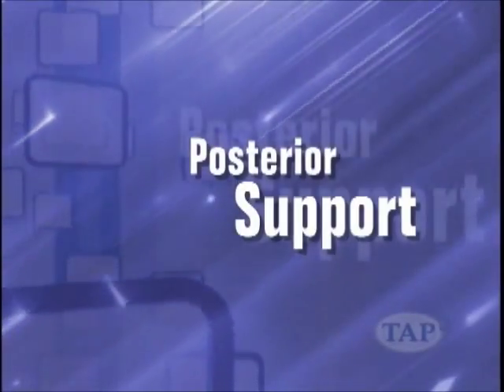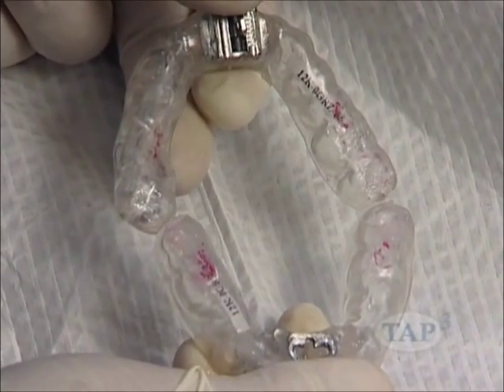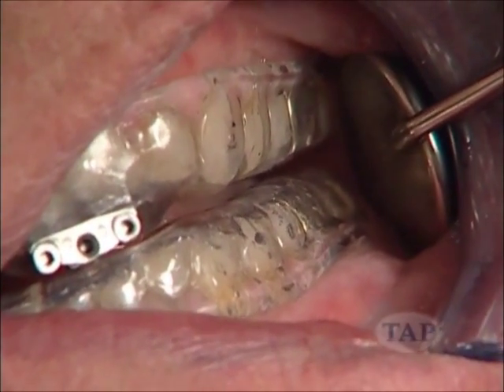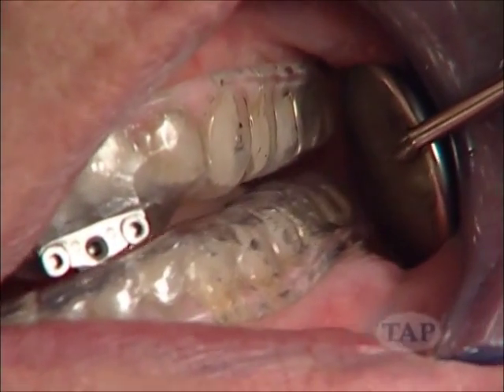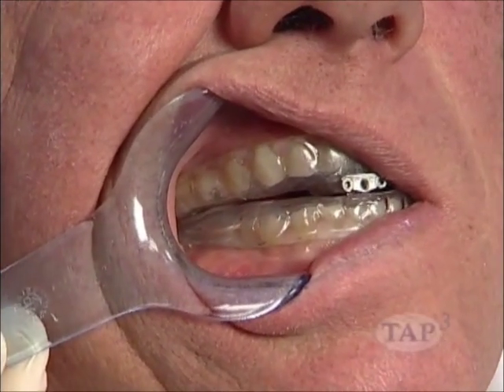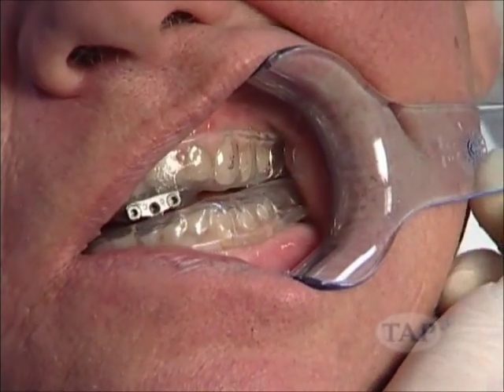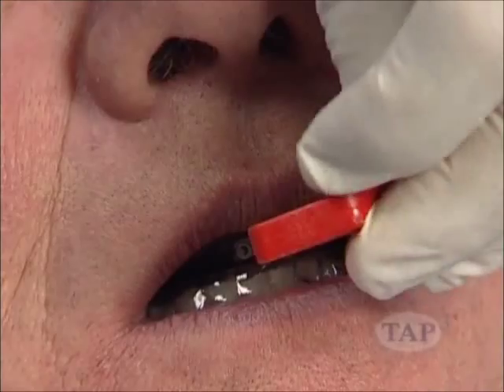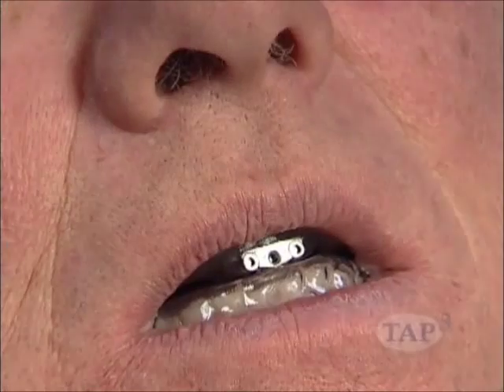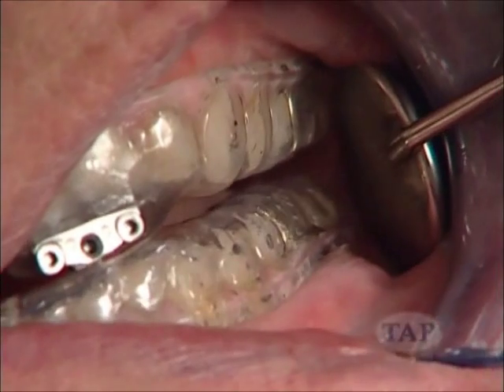Posterior support. Posterior stops can be added at any time to support the temporomandibular joint. It is extremely important that there is a space bilaterally between the trays prior to adding the acrylic posterior stops. The objective is to create bilateral, even posterior stops at the patient's treatment position. Since the relationship of the maxilla and the mandible changes with the changes in protrusion, this procedure must be repeated if the treatment position changes.